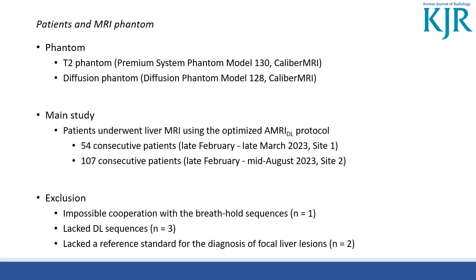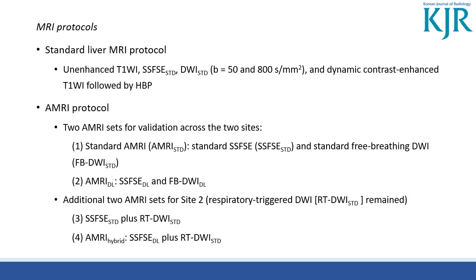In the main study, 54 and 107 consecutive patients underwent liver MRI using the optimized AMRI-DL protocol at each site. Patients were excluded from the analysis if they could not cooperate with the breath-hold sequences, lacked DL sequences, or lacked a reference standard for the diagnosis of focal liver lesions.